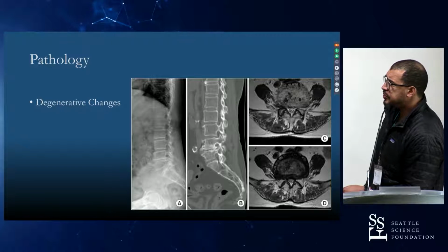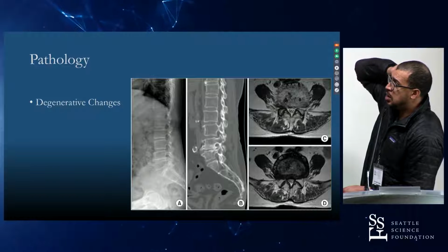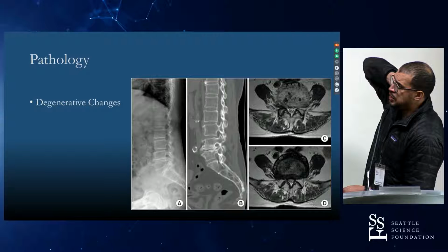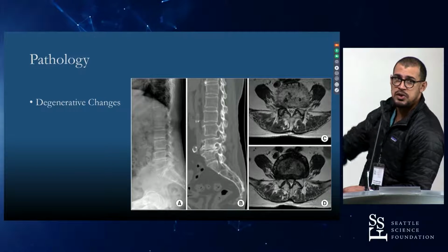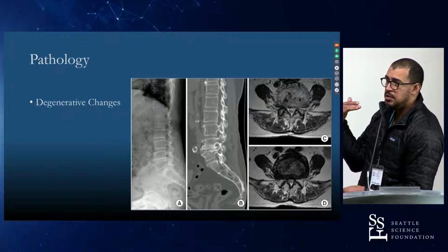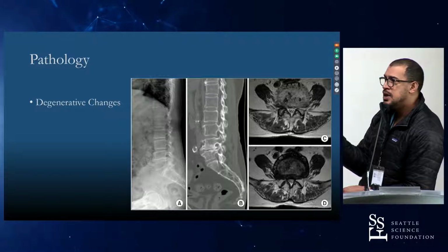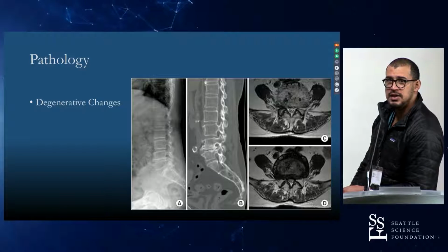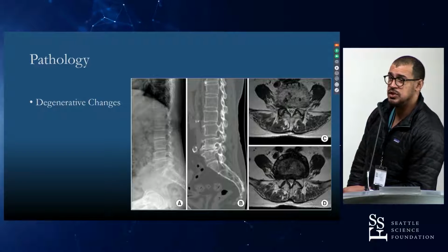And just briefly want to touch on our parameters, our pelvic incidence, lumbar lordosis. You can really come in with a very distinct plan as to how much lordosis you want to dial in. Each one of the constructs will give you a certain amount of lordosis in the cage, but it doesn't always translate to that much in the actual patient. You can say, oh, this is a 30-degree lordotic cage. You're not always going to get that much at each level.